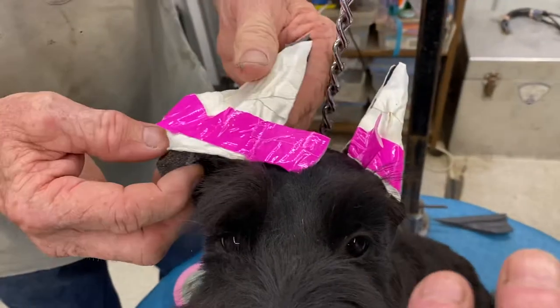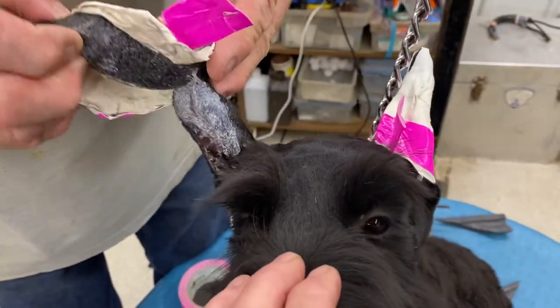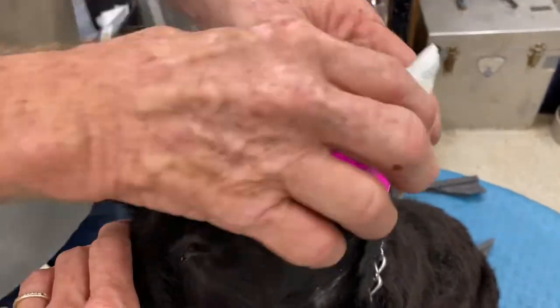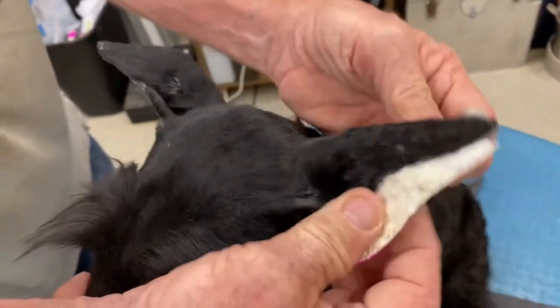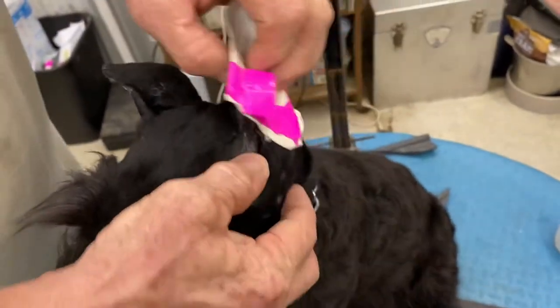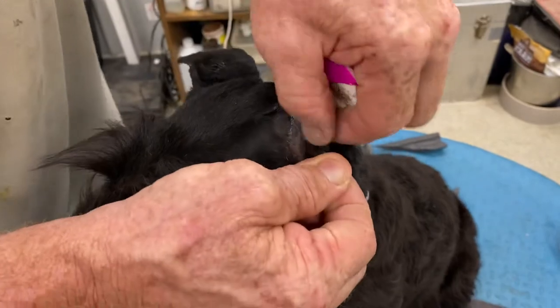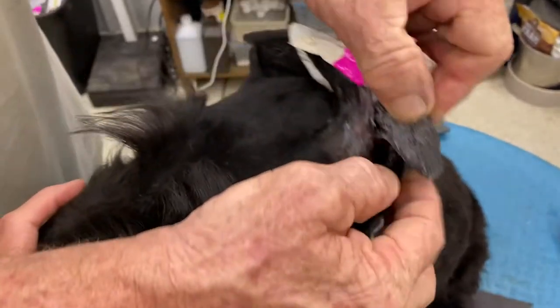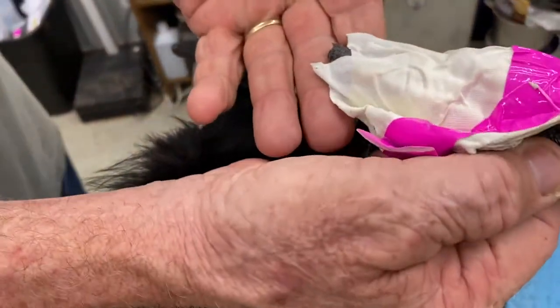Pull it out of the bottom, pull up very carefully, pull the tape off of the ear. Hold the back of the ear so you don't break the ear down.